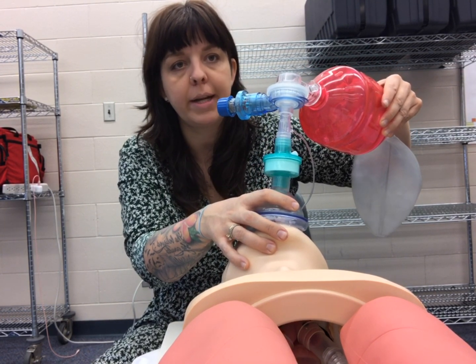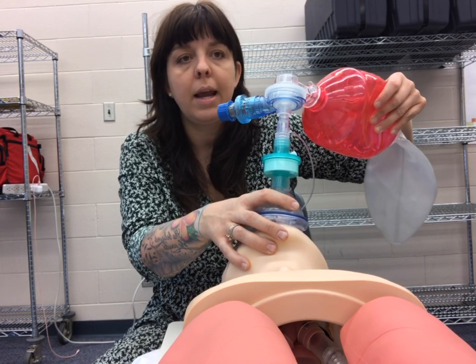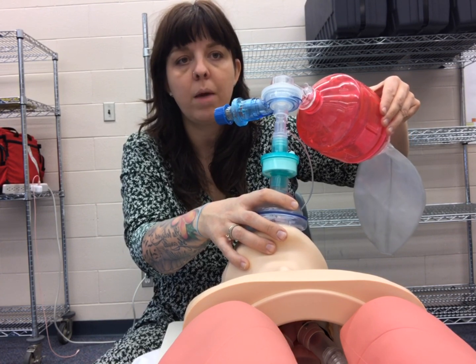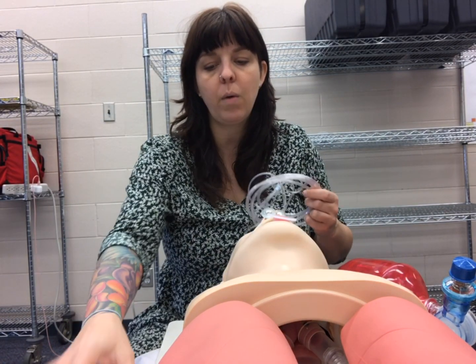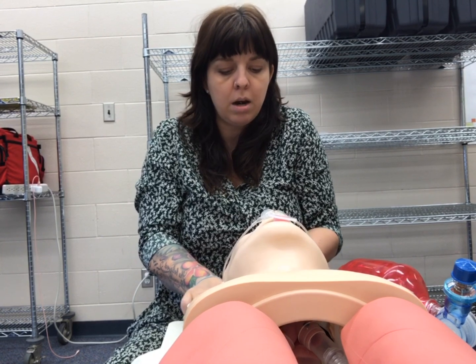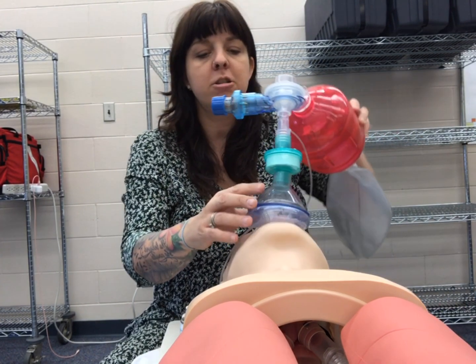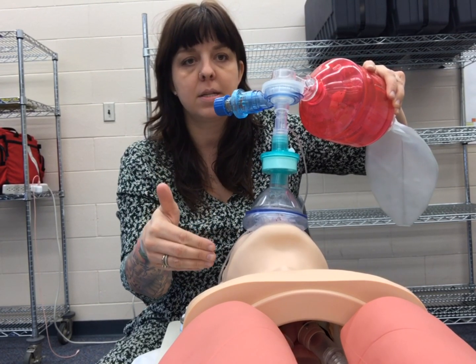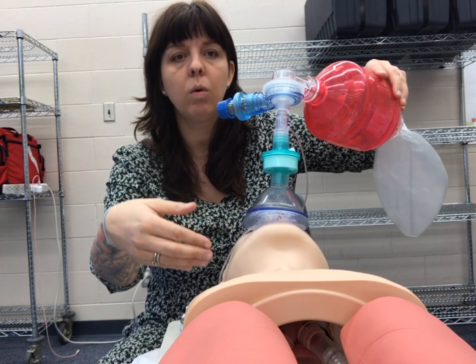We need to protect the airway and deliver oxygen more effectively. While continuing two-person bagging, I'll prepare the patient for the advanced airway procedure. Atmospheric air contains 78% nitrogen and 21% oxygen. I'm going to flow a nasal cannula at 15 liters per minute in conjunction with the BVM at 15 liters per minute for two to three minutes — you must spend the time doing this. You'll likely see the sat rise probably over 90%, but notice how hard you're working to get it close to 100%.